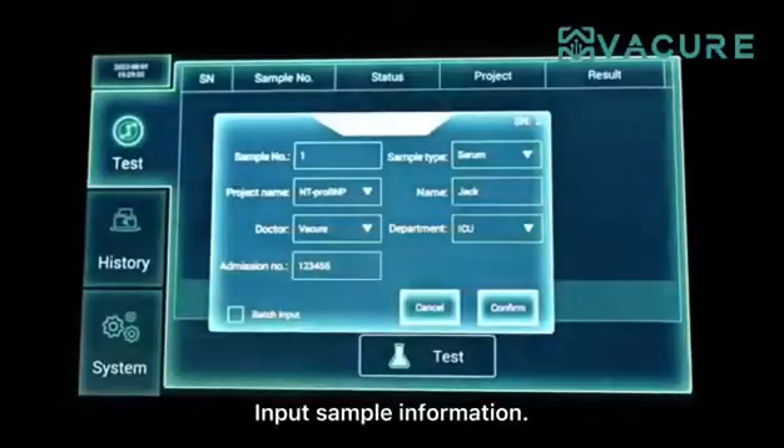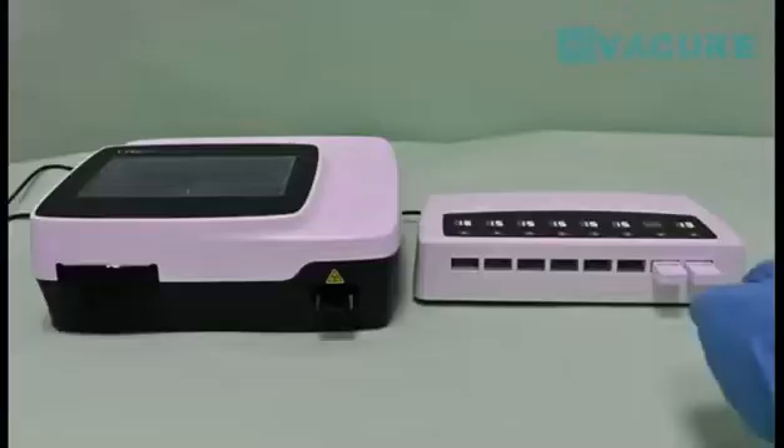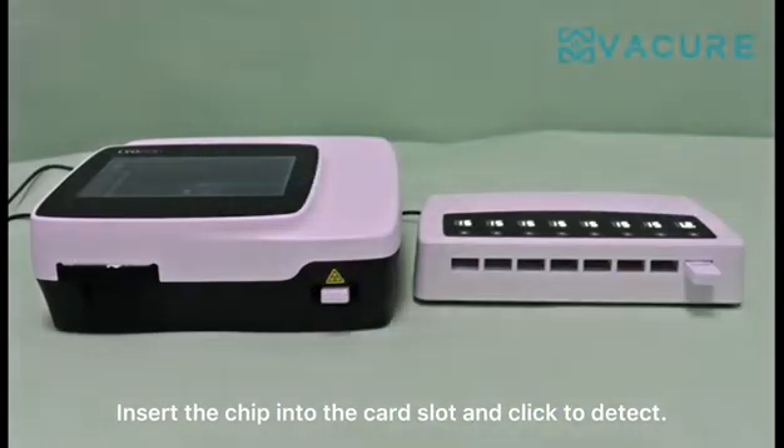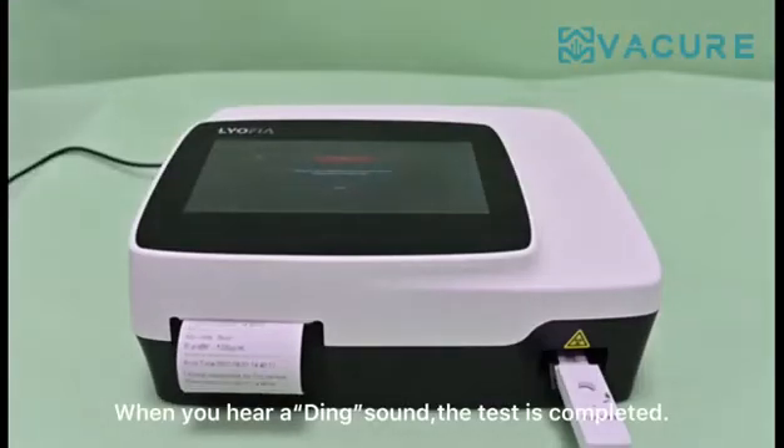Input sample information. Insert the chip into the card slot and click to detect. When you hear a ding sound, the test is completed. Next, take out the test cassette.